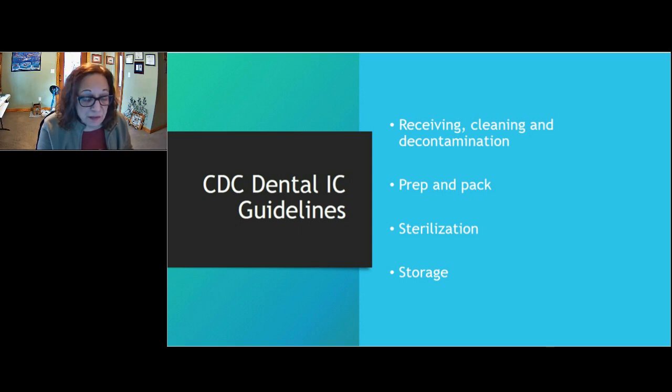A more comprehensive reference would be the AAMI ST79, which is Standard 79, Steam Sterilization in Healthcare Facilities, which does apply to dental as well as medical facilities. And it does actually talk about tabletop sterilizers in there as well, which I know many dental practices use.